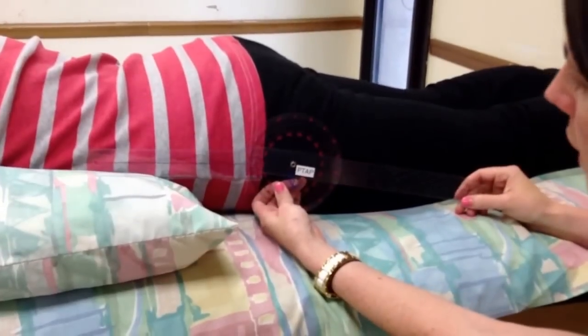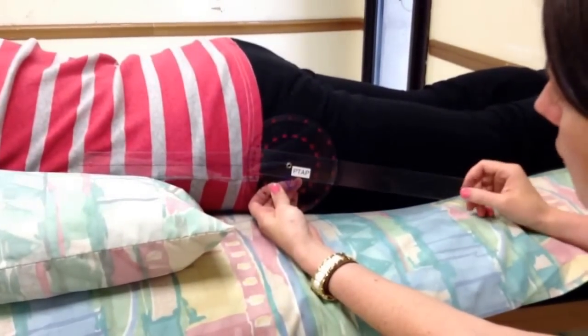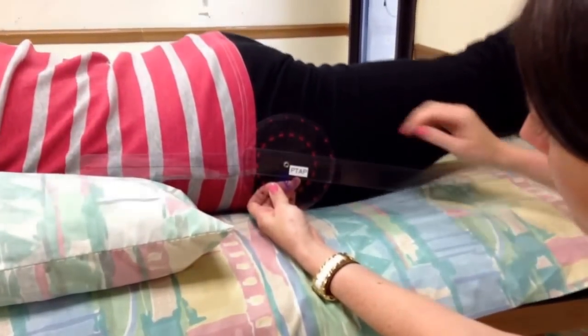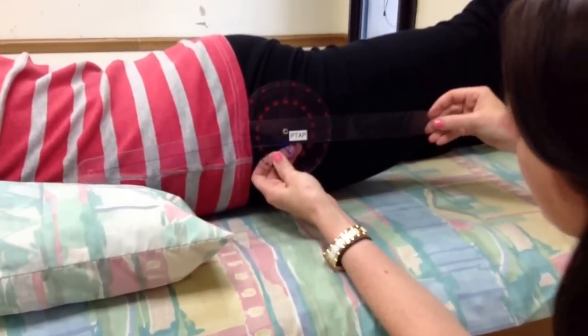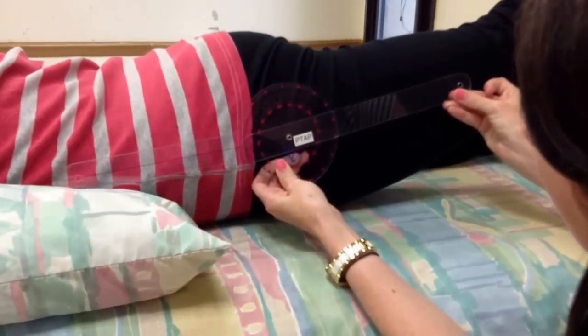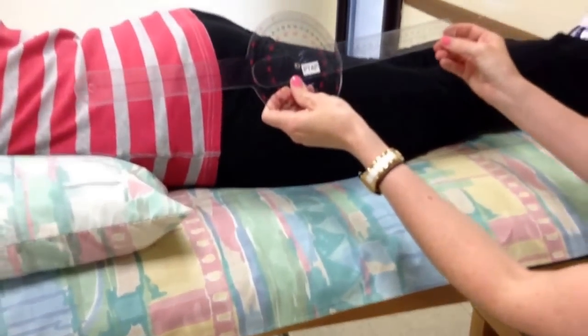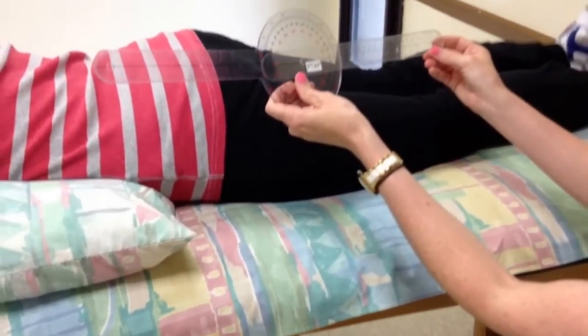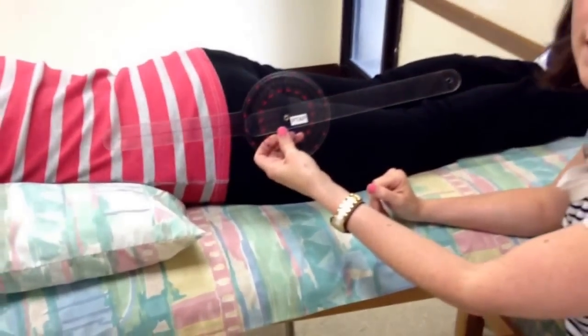Alright Suzanne, if you could bring your left leg up off the bed as high as you can. And take a break. So Suzanne has five degrees of hip extension.